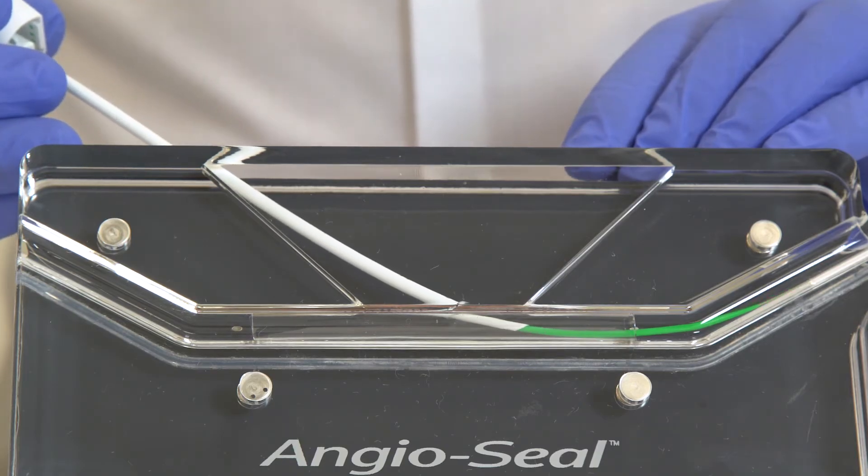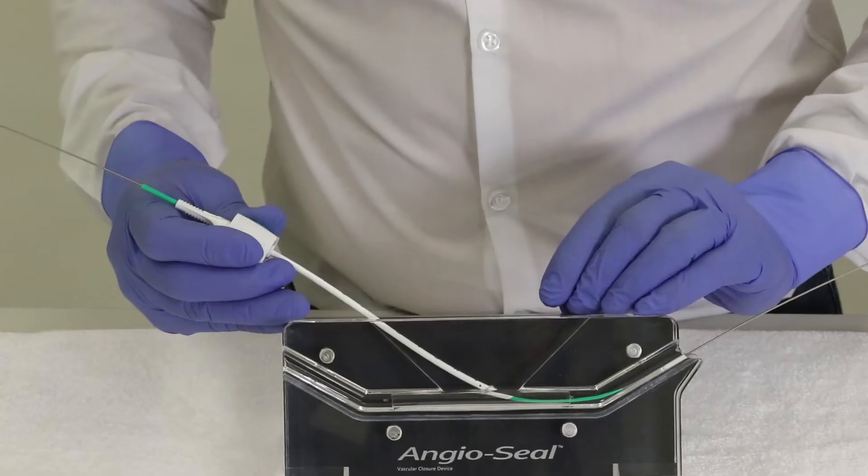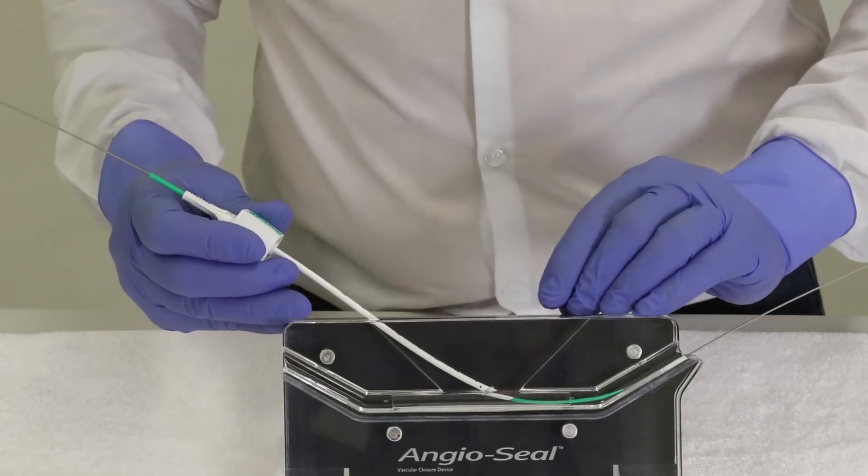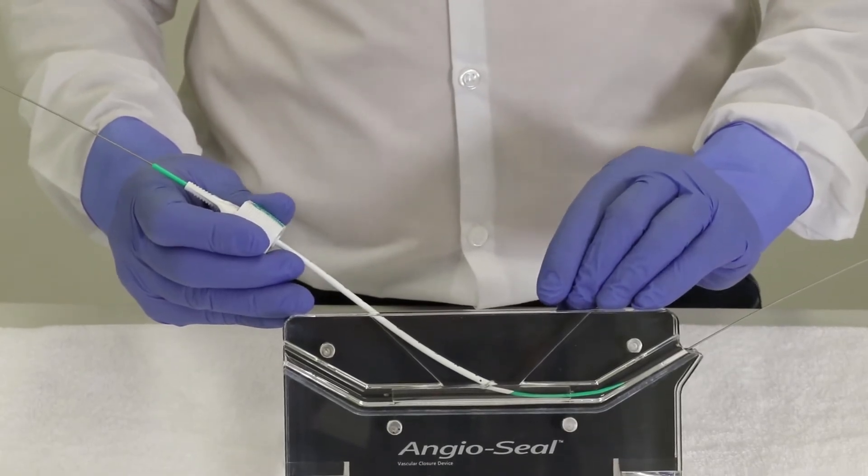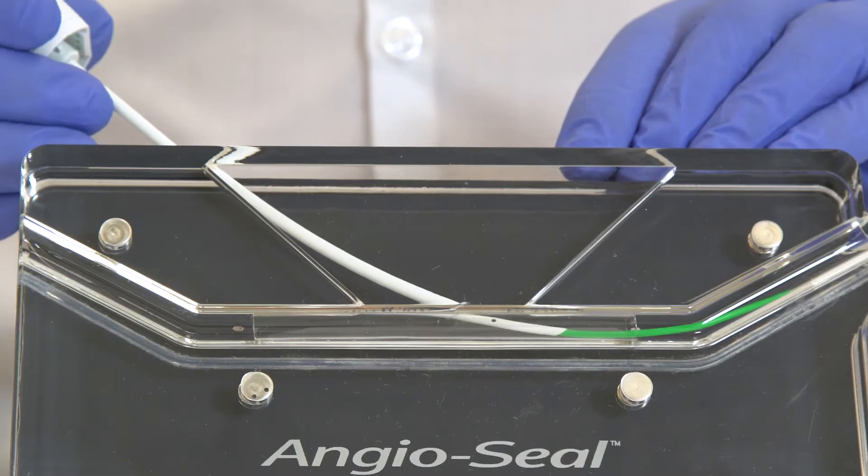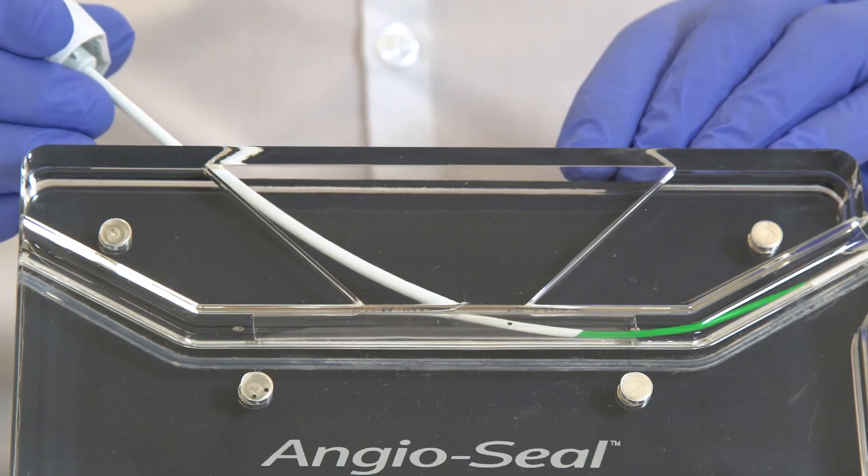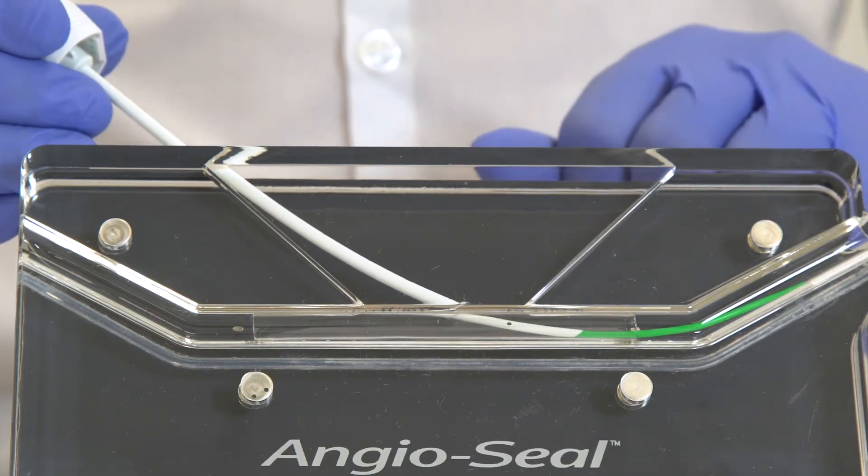And now the holes have come outside of the artery. The flow has stopped, so now advance the sheath again no more than one and a half centimeters until you have pulsatile flow again. Now we are back in the artery.